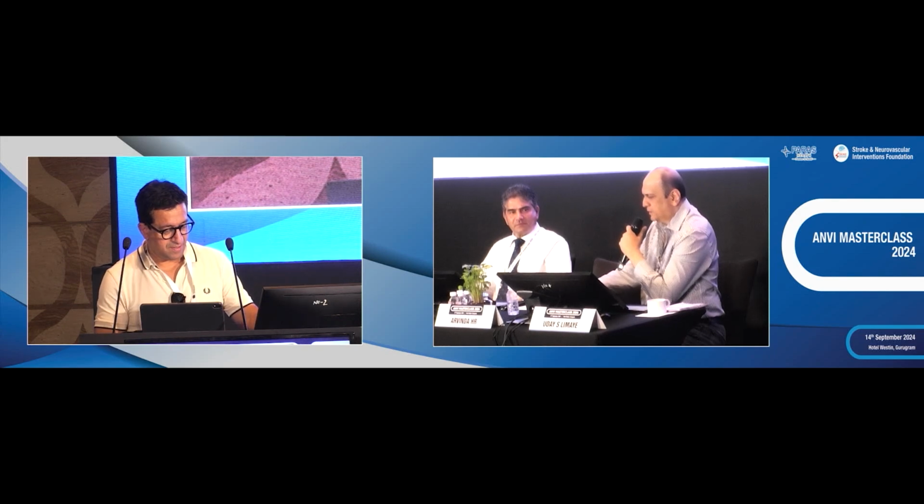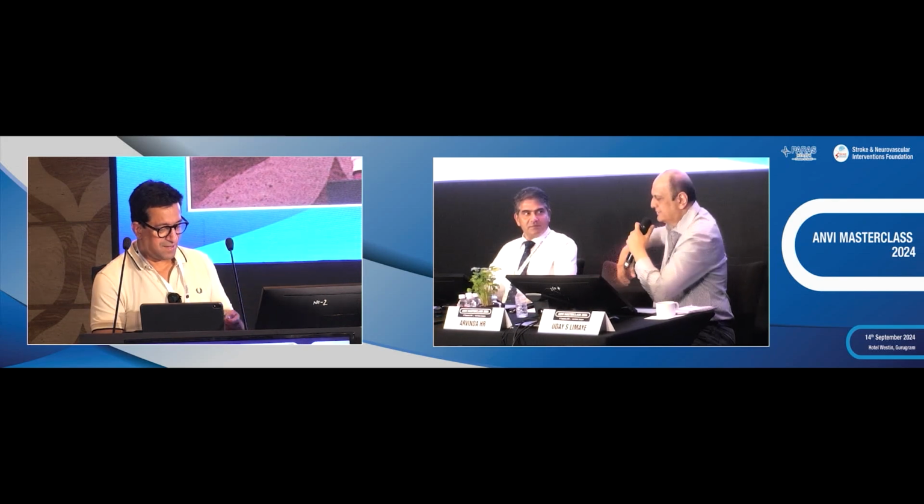So before you go to RTs, or you may not go to RTs, there are a couple of comments that I will make, which is for our geography. And that comment is about the sizing. You're very, very right in saying that if you undersize, then the aneurysm is just going to come back. A few years ago, there was a euphoria of the fastest 100 Contours happening in India. Very quickly, over 100 Contours were deployed.